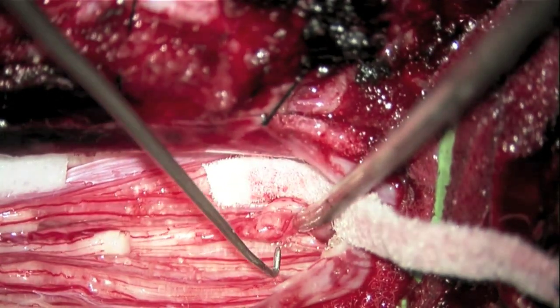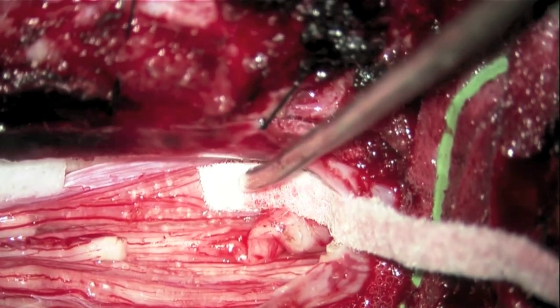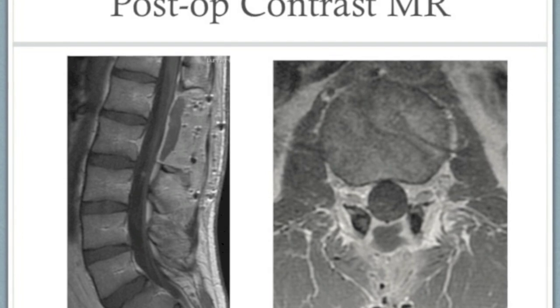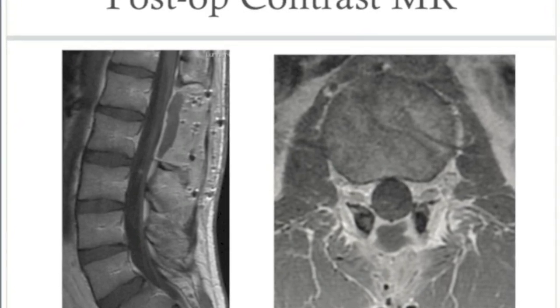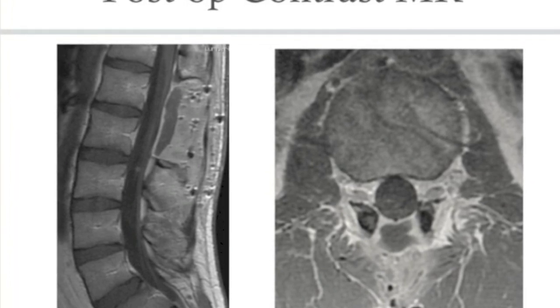Stimulation of the corresponding nerve root produced robust responses in the right vastus lateralis and other L4 innervated muscles. Early postoperative contrast-enhanced lumbar MR shows a clean resection bed without evidence of residual tumor. The MR will be repeated 1 year postoperatively.